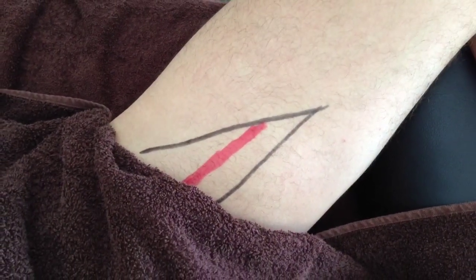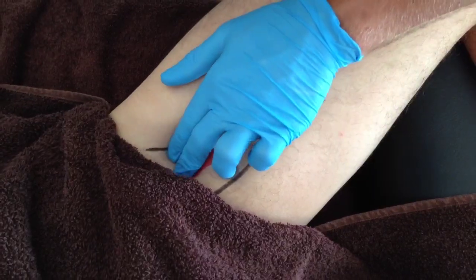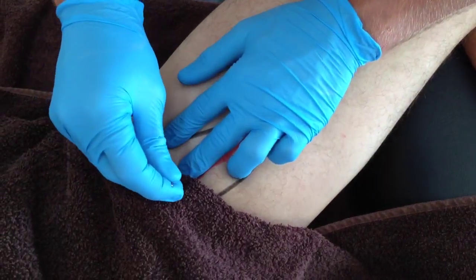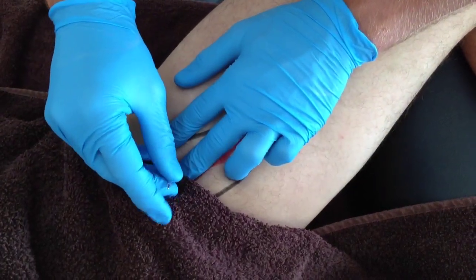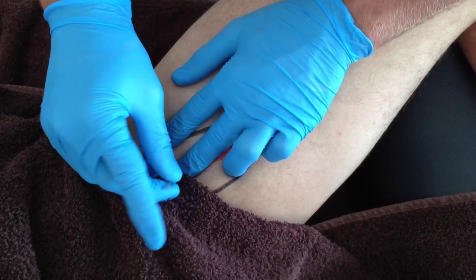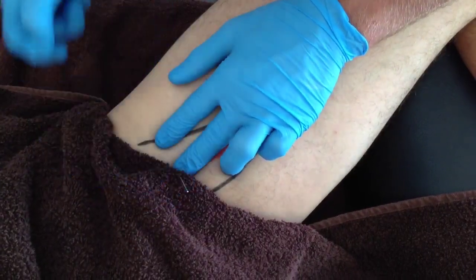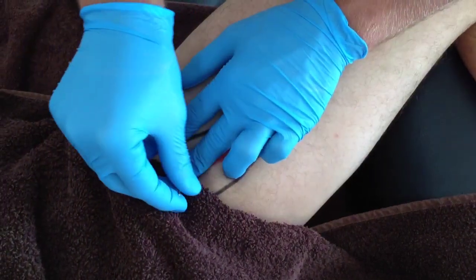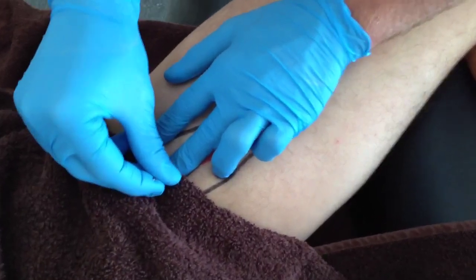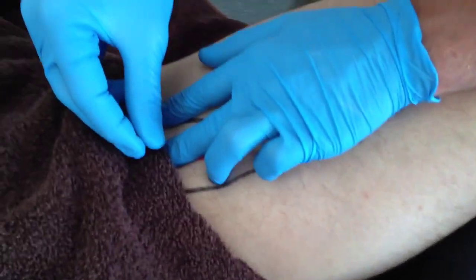You should then be in a safe position to apply the needle in a slightly lateral direction, away from the femoral nerve and artery. Given the deep nature of this trigger point, it is unlikely that a visual representation of the twitch response will be elicited.